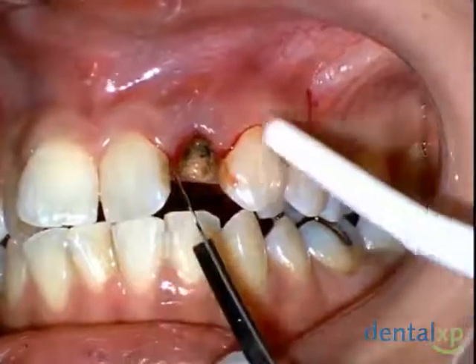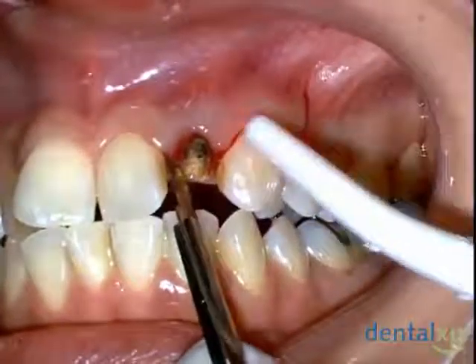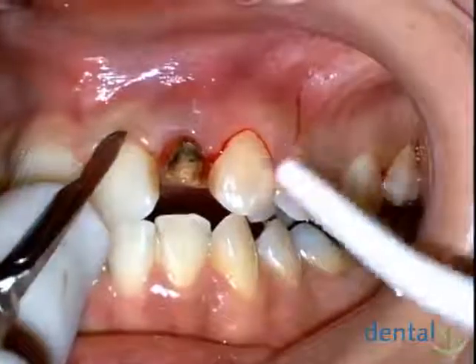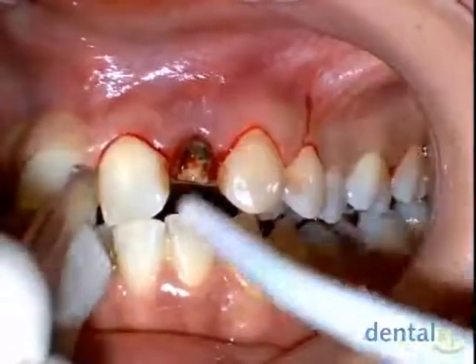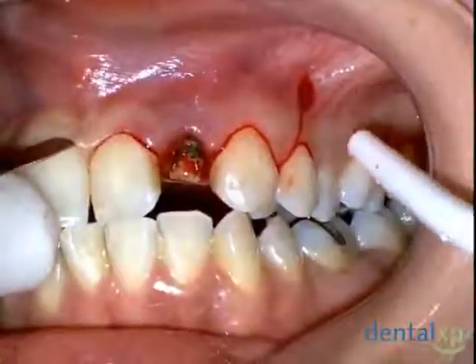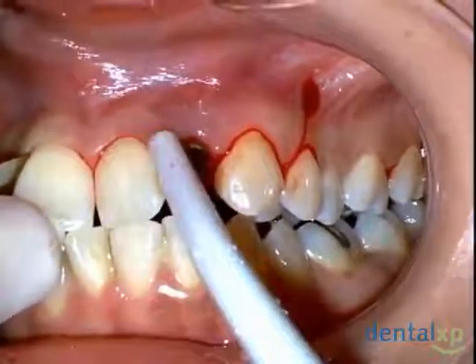Full thickness flaps and sulcular incisions are going to be utilized, and usually we prefer to hide the vertical incisions distal to the anterior space whenever possible, and therefore a single vertical incision is usually appropriate for the regenerative procedure that we're going to be performing today. Sulcular incisions are then going to be utilized across the midline.